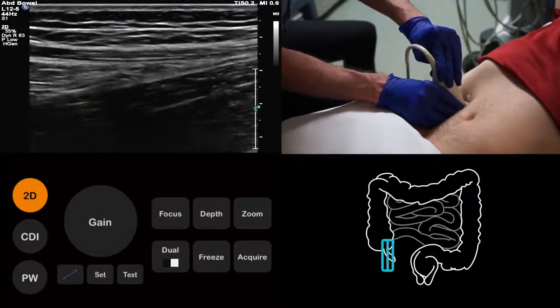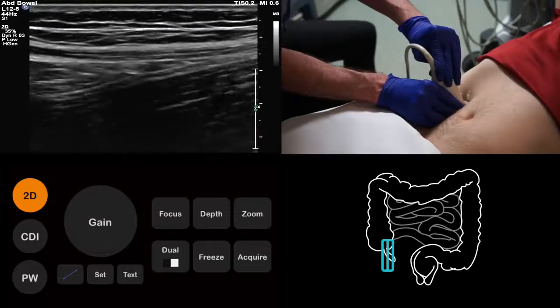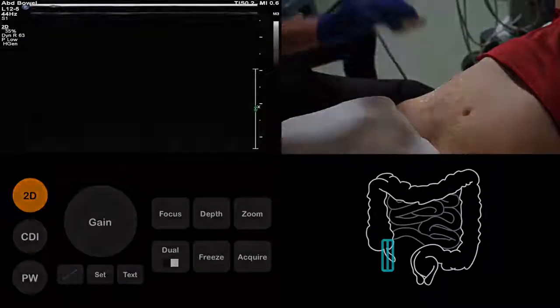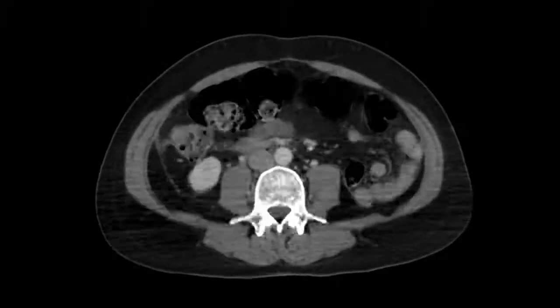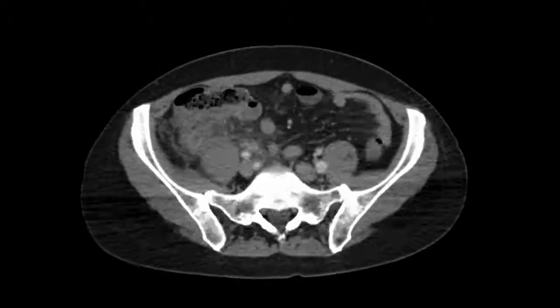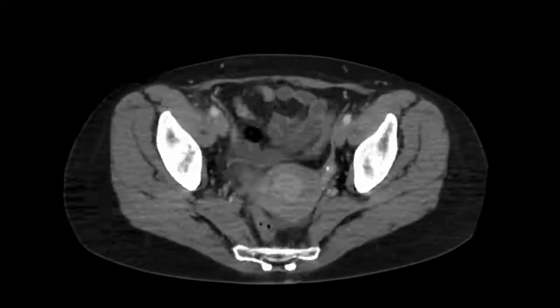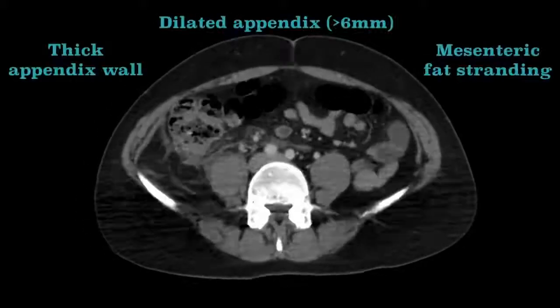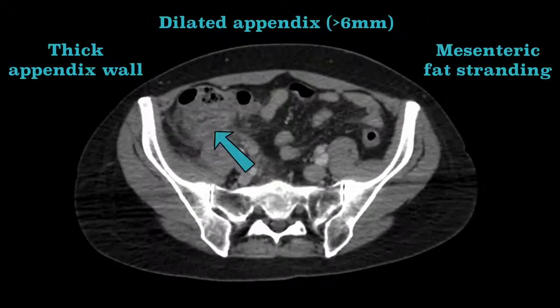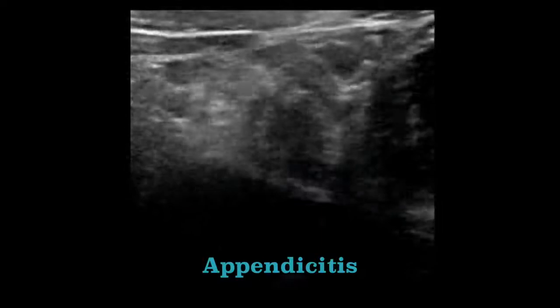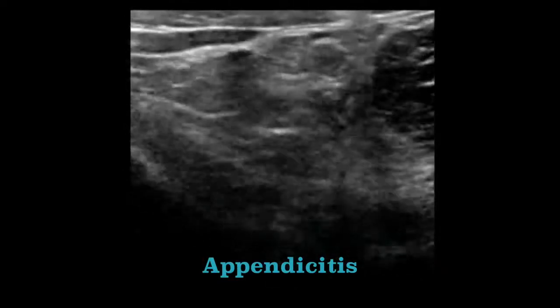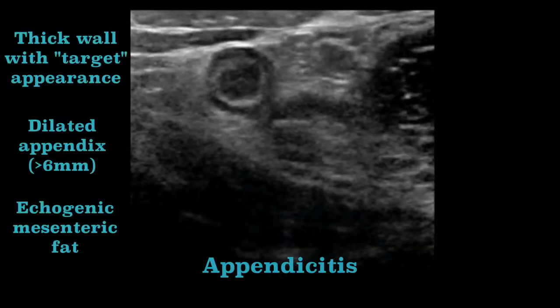Having gone through a strategy for scanning the appendix, we should now talk about the ultrasound appearances of appendicitis. It is useful to review the CT appearances of appendicitis, as there are some important similarities. In this example of appendicitis, we can see a thick-walled, dilated appendix with surrounding fat stranding. We can actually see the same things with ultrasound. In this example, we have the thick-walled, dilated appendix just as we saw on CT. We can also see evidence of the fat stranding, as the mesenteric fat appears diffusely echogenic.